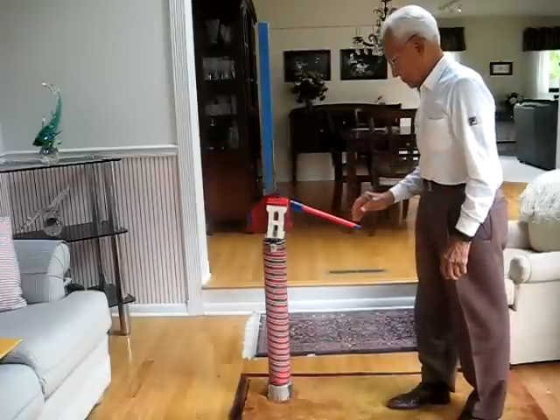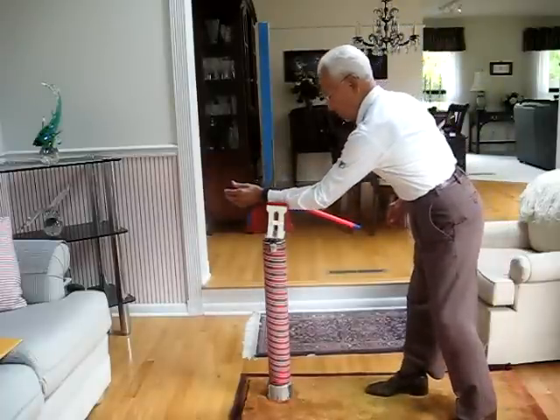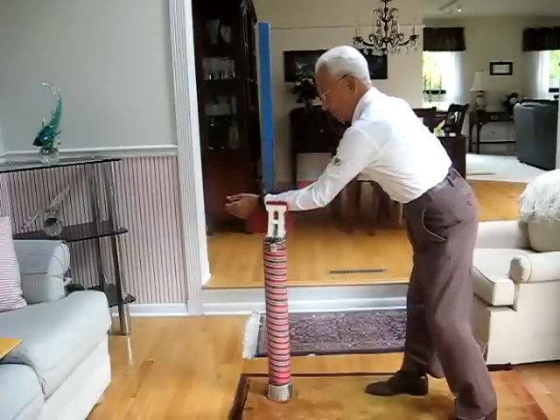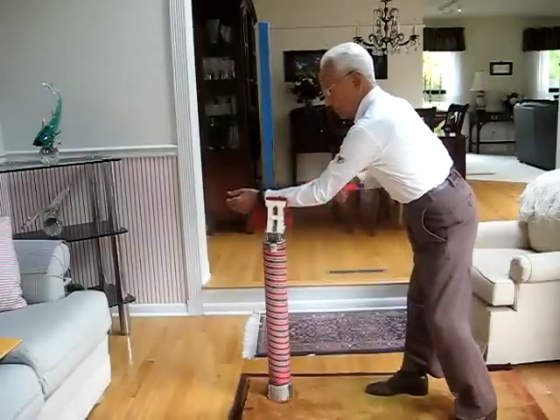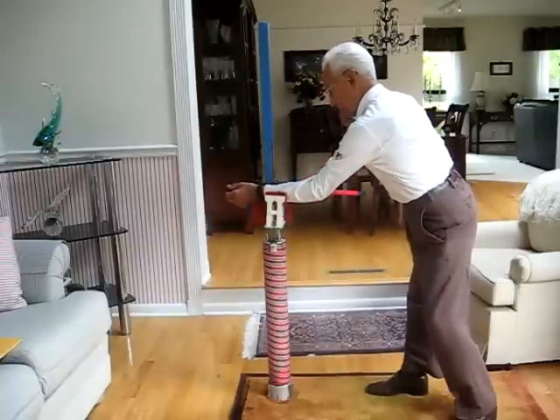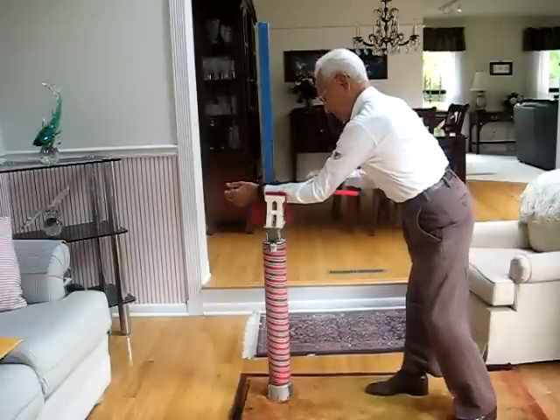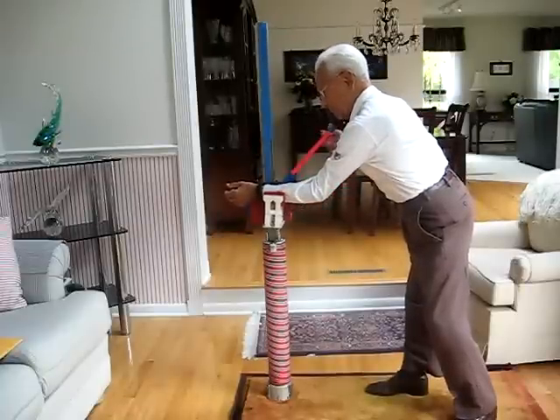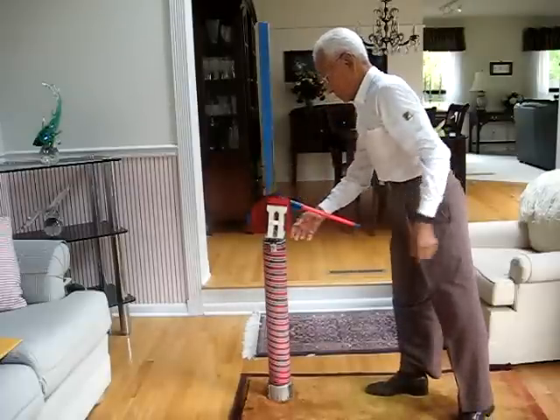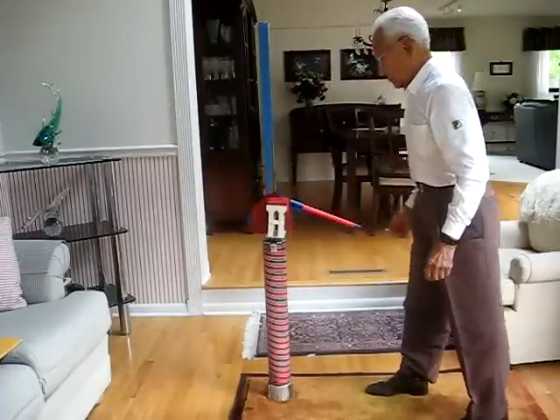By placing the foot onto the holder and raising the jack slowly, the operator raises his foot up to a comfortable height, holds it there for a few seconds, and then releases the jack, bringing the foot back down. Then you repeat the procedure with the other leg.